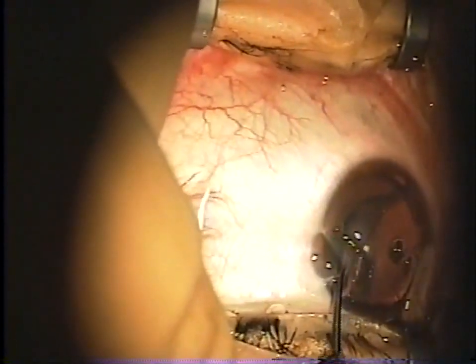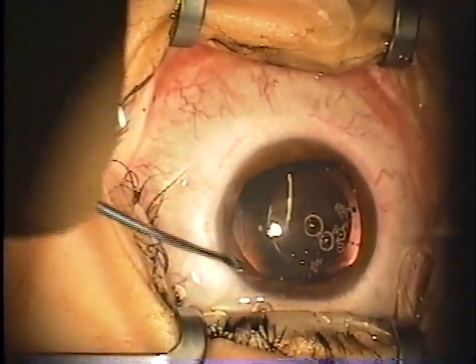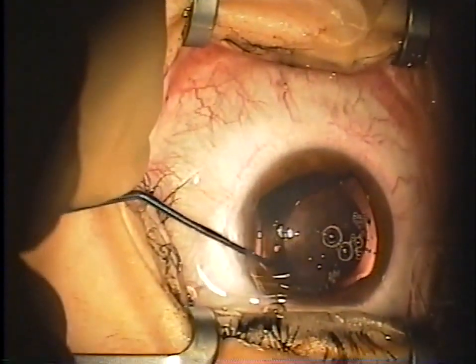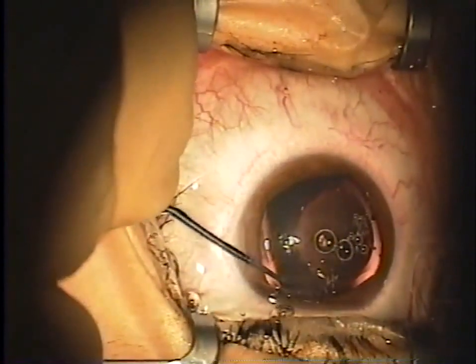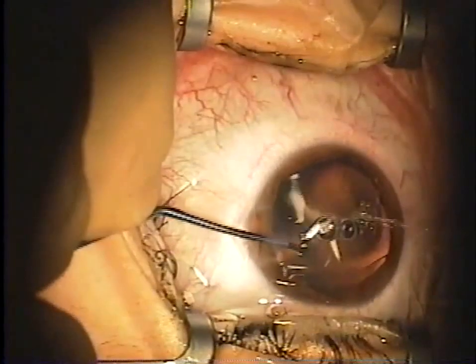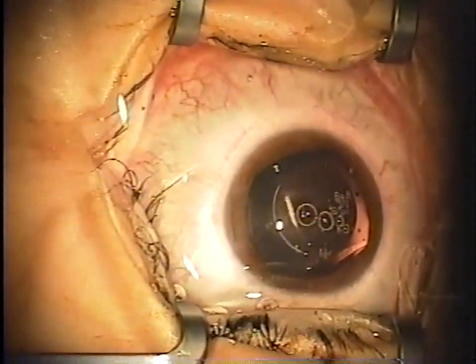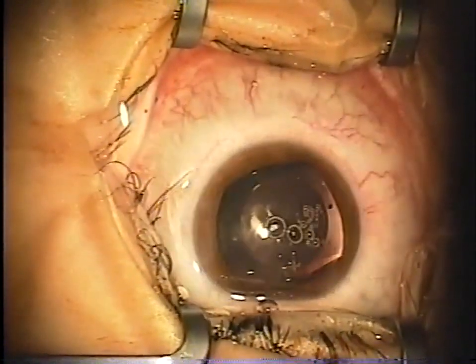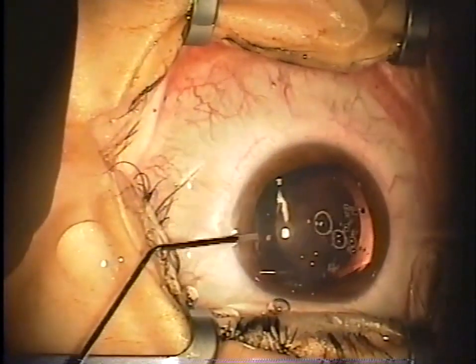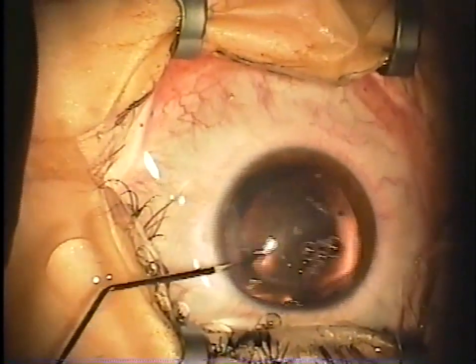This lens is great for people with mild to severe myopia. It comes in powers of -3 to -20, and that is a spherical equivalent. So people who have very high myopia and are not candidates for LASIK are great candidates for this lens. It's also a great procedure for people who don't want to spend the extreme amount of money to get their own excimer laser, and as a result you can do this with a standard cataract set and a few instruments like that IOL manipulator. So next I'm just rinsing out a little bit of the OcuCoat with some dilute Miostat.